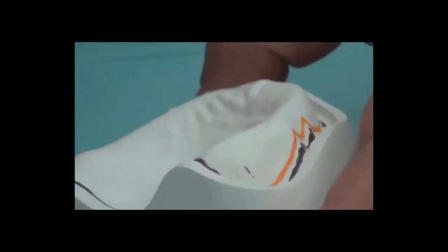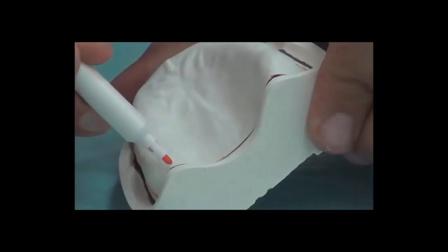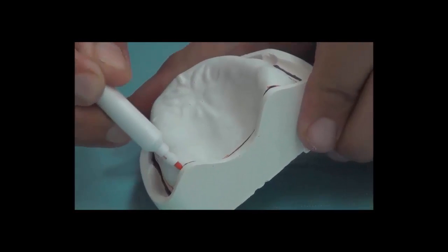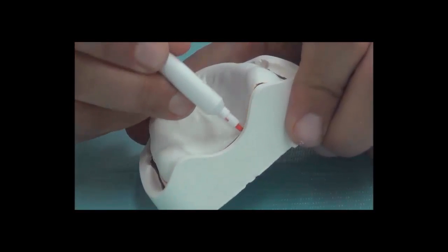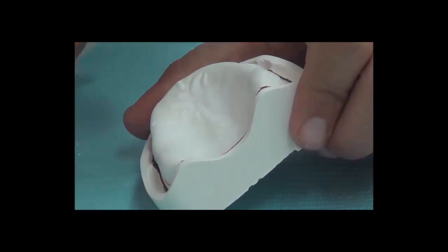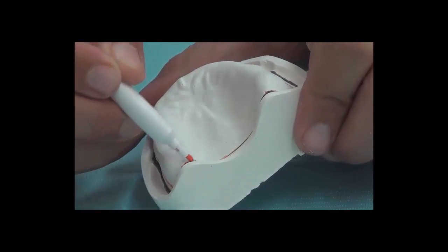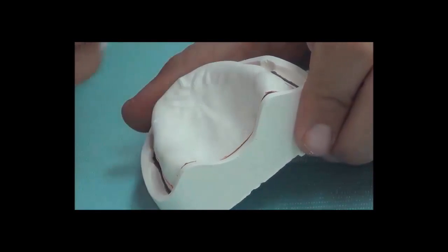For the posterior area, these two lines meet. We're going to make the tray on the same line drawn posteriorly. So these two lines meet in the hamular notch area. So the tray should extend into the notch. It doesn't end on the tuberosity, it ends inside the notch, the hamular notch. So this is our outline of the tray.